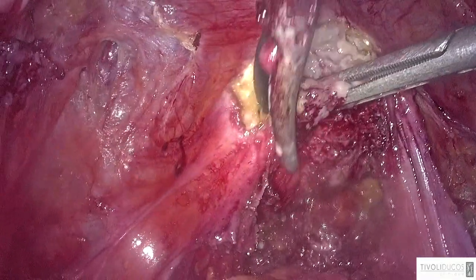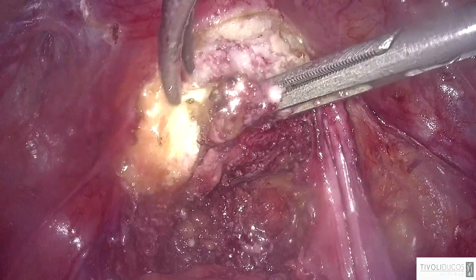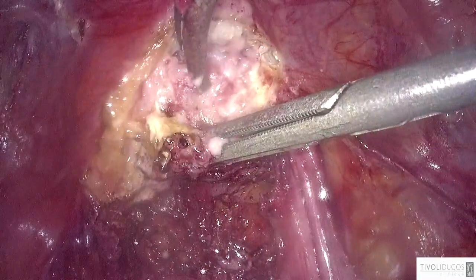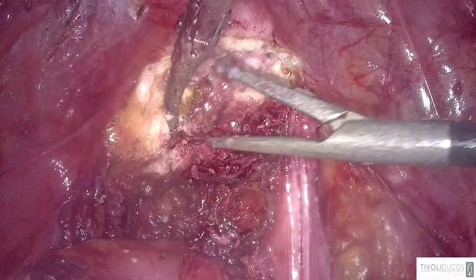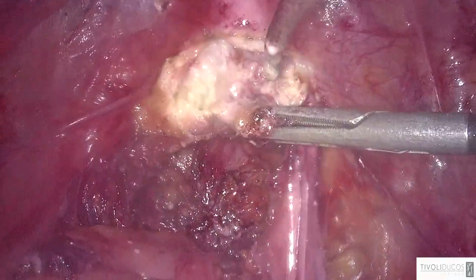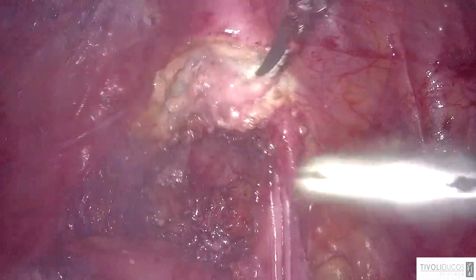And I push the finger in order to understand which is the lateral limit of the vaginal infiltration. Until last week, in very big nodules like this, I used to carry out a first vaginal step. And I carried out more than 80 procedures like this, but the vaginal step was always done with a short endoscope, and I had this endoscope in Rouen. I do not have it in Bordeaux.